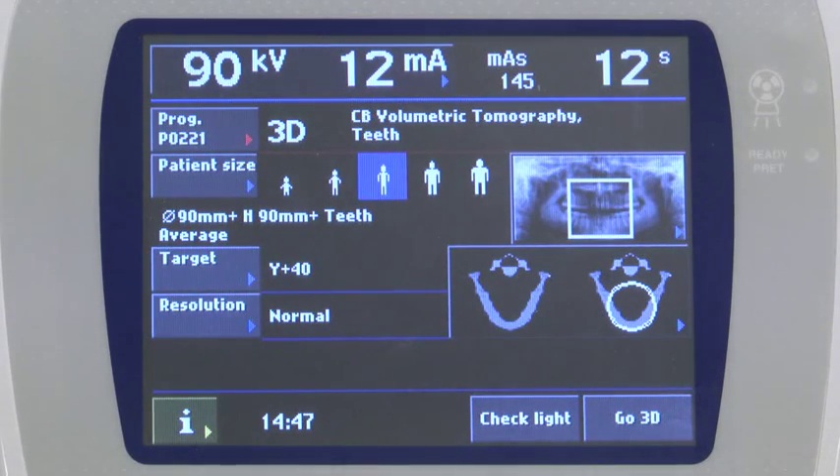Select the appropriate patient size. This automatically selects the proper KV and MA. Select the desired resolution.